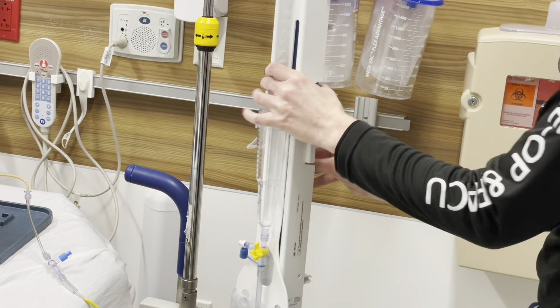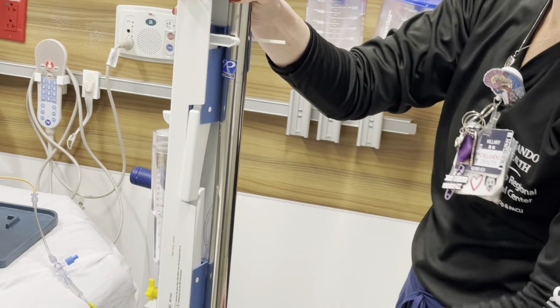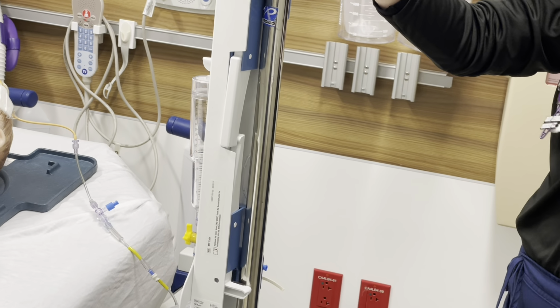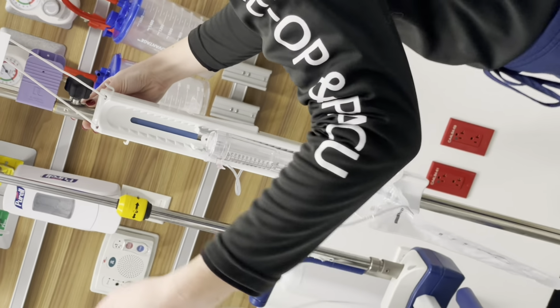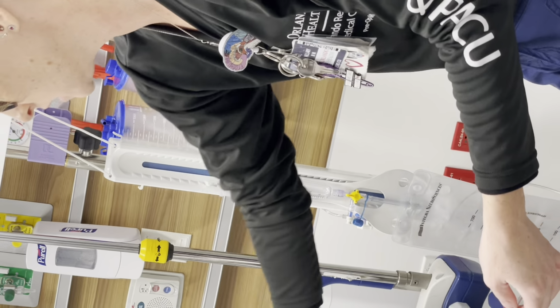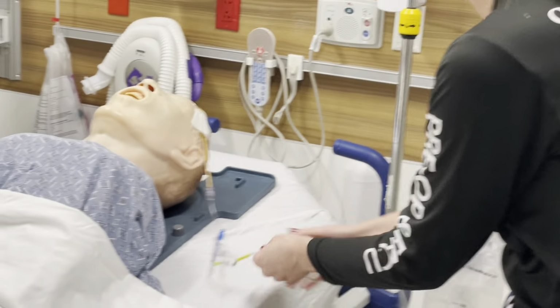It also comes with these little safety straps on the back where they will attach this way and attach this way. Normally they have a little piece on here. They will hold snug, so you have two devices to make sure that it's not just going to fall off the pole. And you want to make sure that you're not twisted all around and that you're sitting on top of all your other wires, because again, you don't want anything to fall on this and pull it from his head.